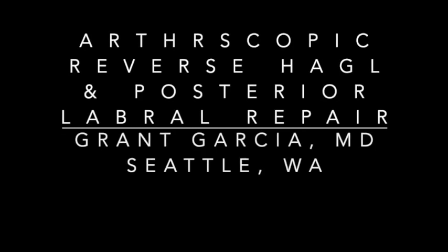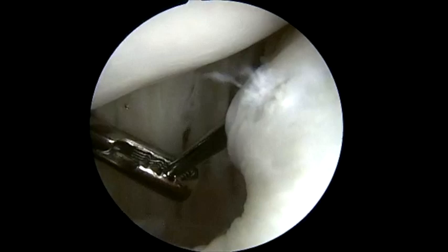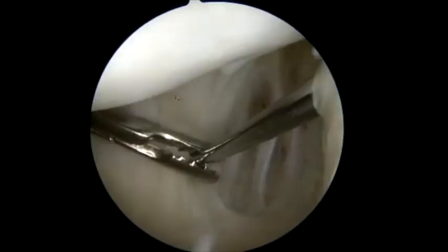Today we're going to demonstrate our technique for an arthroscopic reverse HAGL with a posterior labral repair. This patient had continued instability, identified to have a HAGL on MRI. It was found to have a complete reverse HAGL, or posterior avulsion of the inferior glenohumeral ligament.